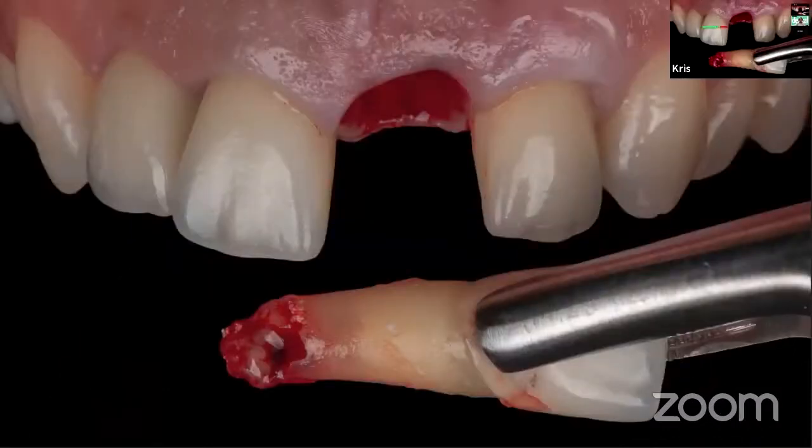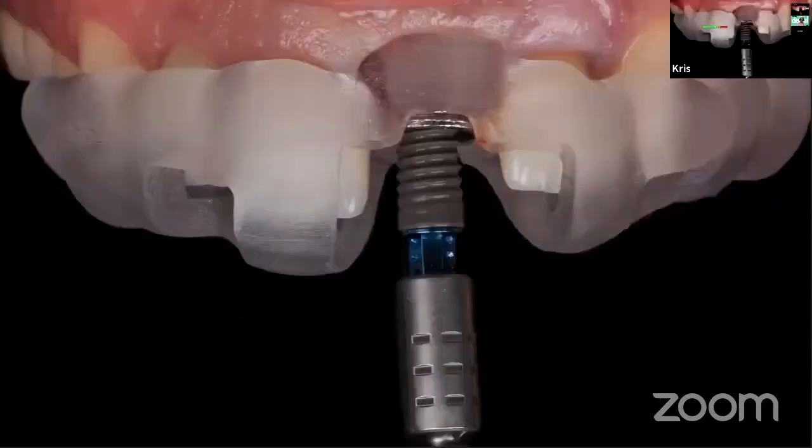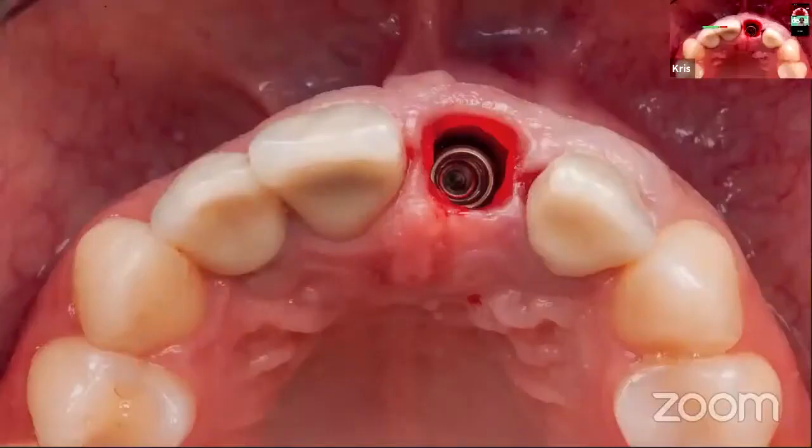I am an implantologist and I graduated in 1993, but I started with implantology in 1996. So I have almost 25 years of experience, but for a couple of years now we have been doing 100% of cases with guided surgery. So it doesn't matter if it's a single tooth or a full arch with all-on-4 or all-on-6.